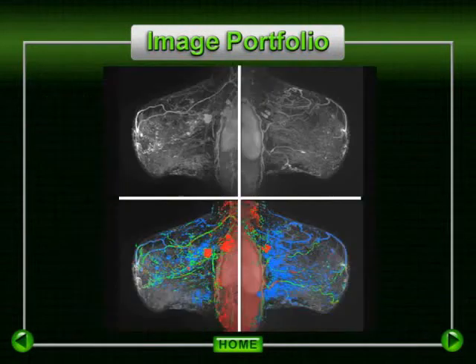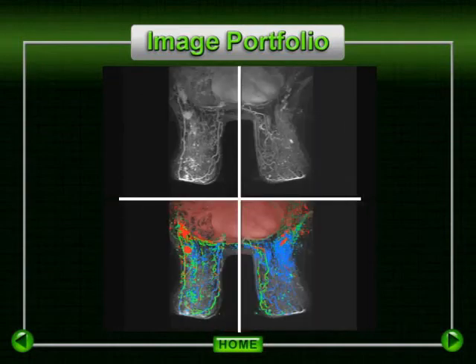Here's an example of our standardized imaging portfolio. In keeping with our approach to image interpretation, we first save the 1-minute subtraction MIP image. We will then usually save the image with color parametric mapping overlay. We subsequently save an orthogonal MIP of the 1-minute subtraction to provide orientation as to the precise location of any abnormality.